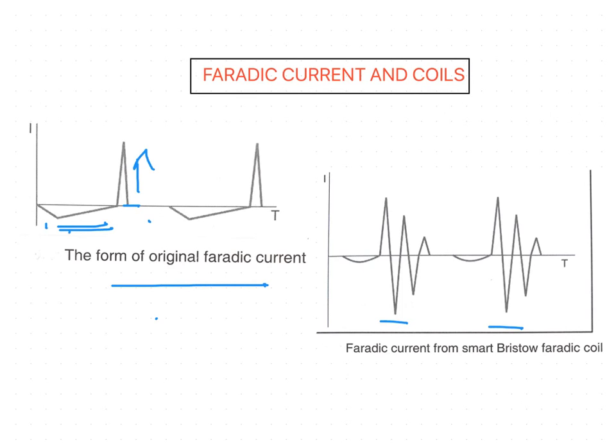In addition, various types of valve operated apparatus have now been developed, producing currents that give rise to the same physiological effects as the original Faradic current.